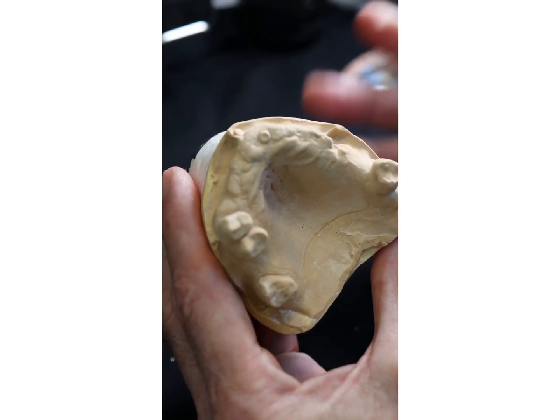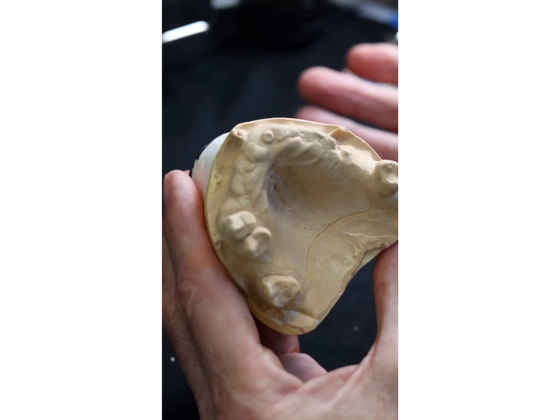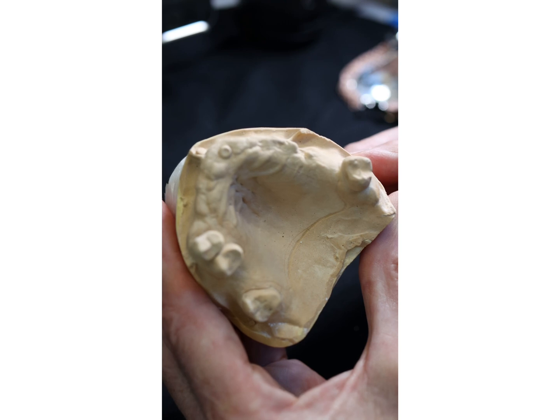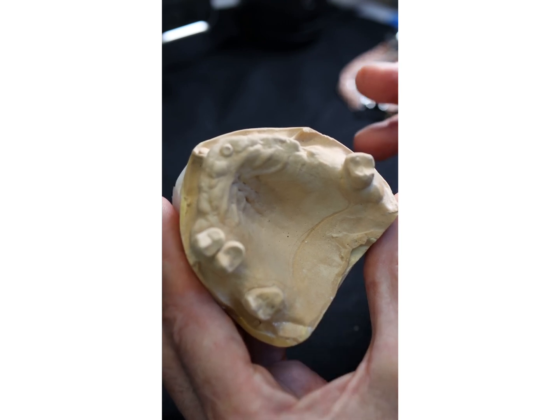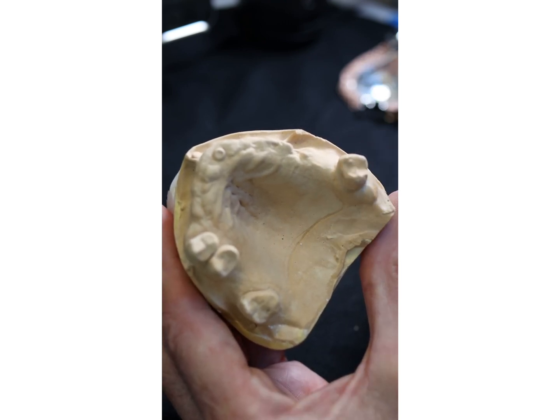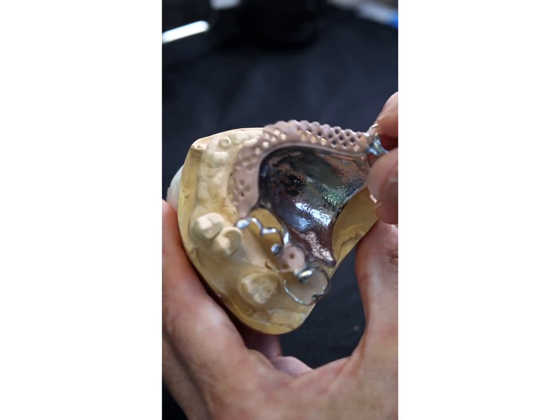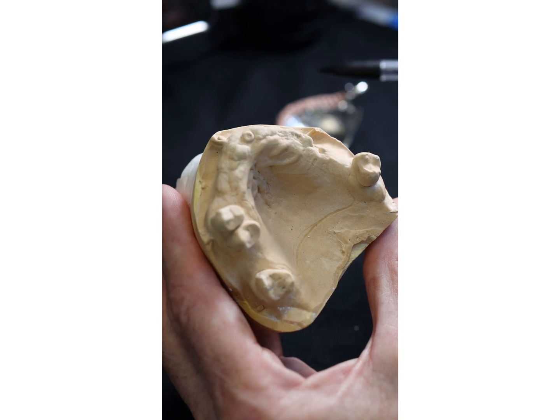I'm going to talk about this chrome now. What keeps partial dentures in is not just clasps — please, nobody say suction, because you don't get suction when you've got hard tissues against a hard denture base. So this Cobalt Chrome we were talking about earlier — what keeps this in is a combination of issues.